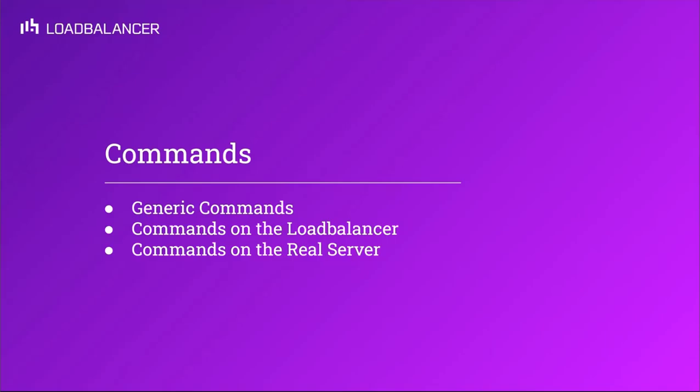The question is, are only physical devices allowed for RIS and PACS, or is a virtual load balancer allowed? At current, Loadbalancer.org will only be supplying Philips with hardware units. We haven't validated against the virtual solution. So you might be able to use other load balancers virtualized for the RIS and PACS, but from Loadbalancer.org, it's only hardware we'll be supplying.